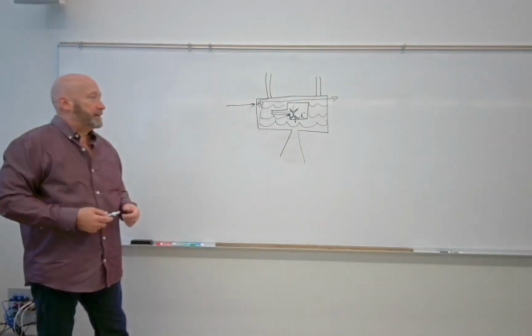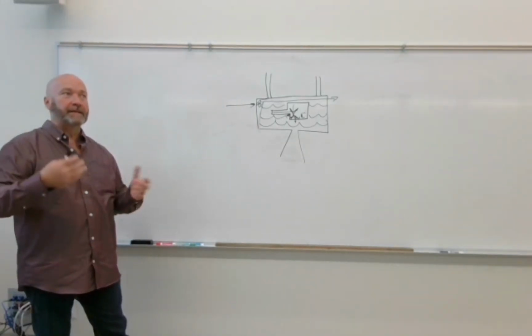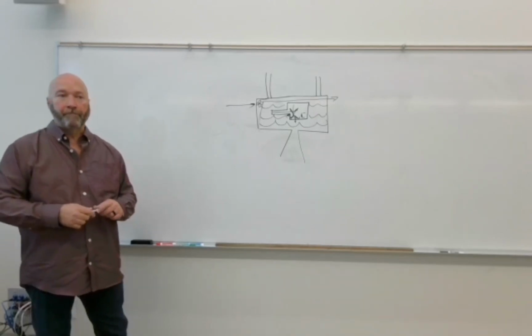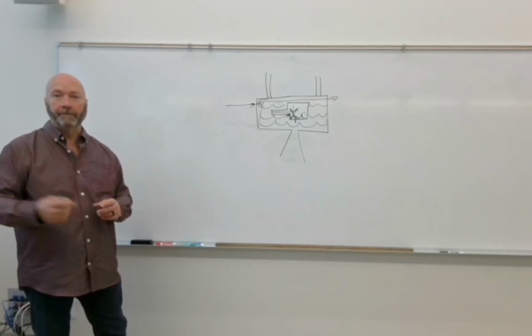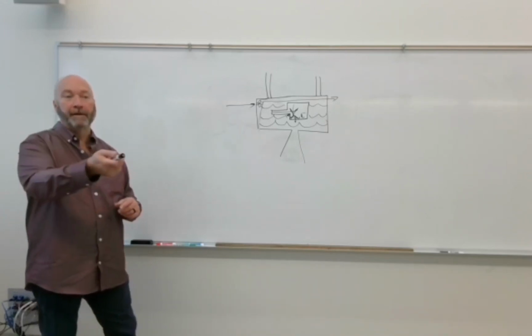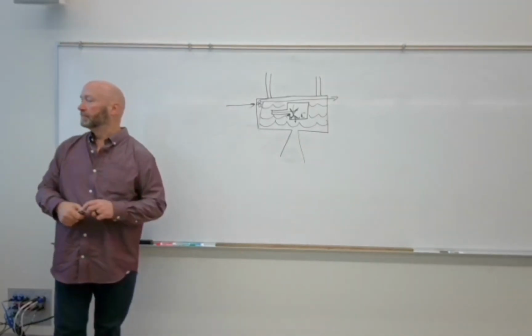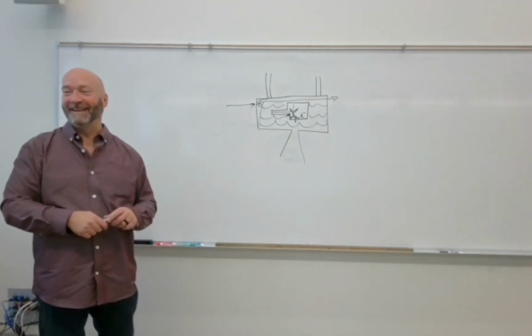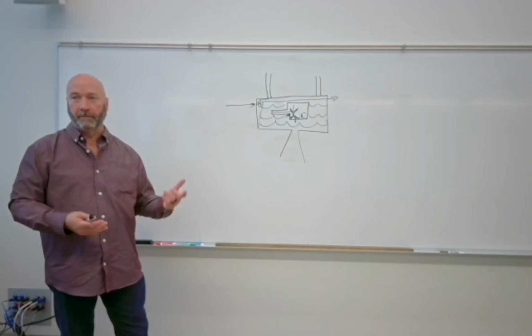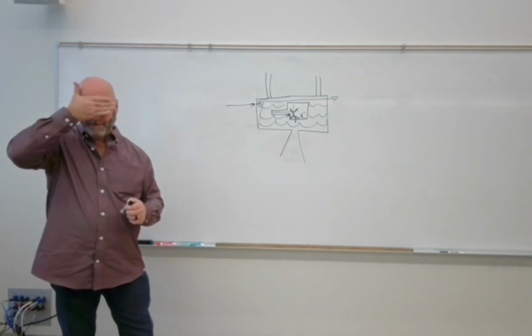The other thing that it does is it limits leakage radiation. What's the distinguishing characteristic of X-rays over visible light? They're both radiation, but they penetrate. X-rays penetrate things that light won't. I mean, can you see my eyes?